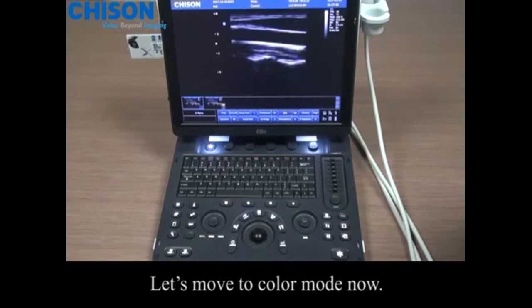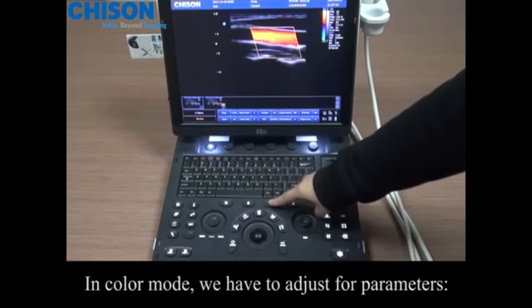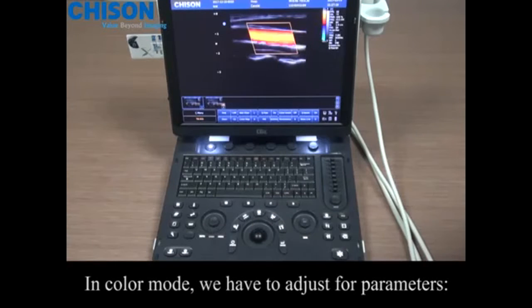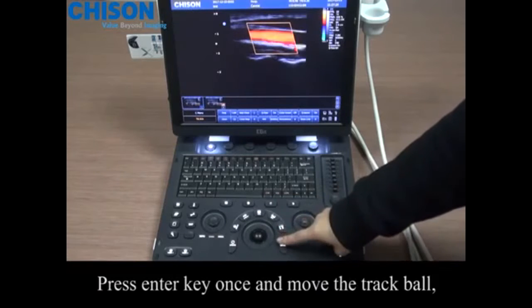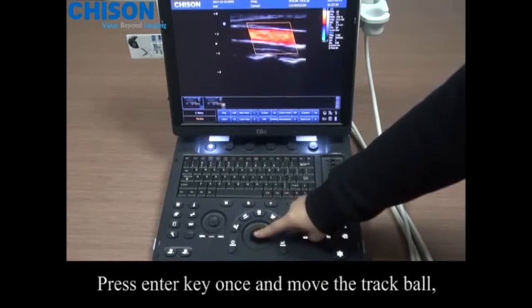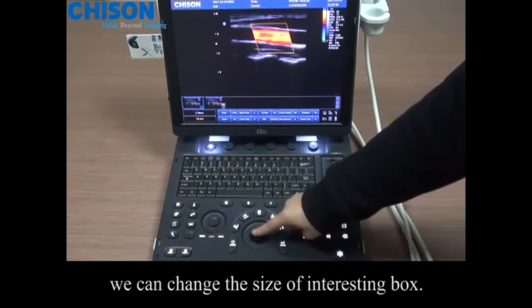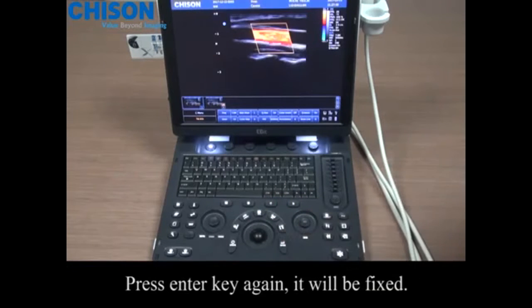Let's move to color mode now. In color mode, we have to adjust 4 parameters. Interest box, color gain, PRF, and WF. Press Enter key once and move the trackball. We can change the size of the interest box. Press Enter key again, it will be fixed.